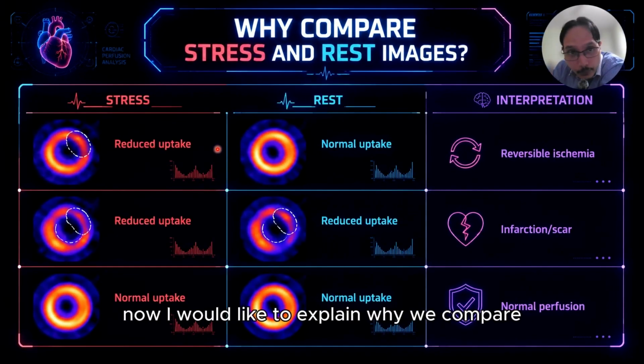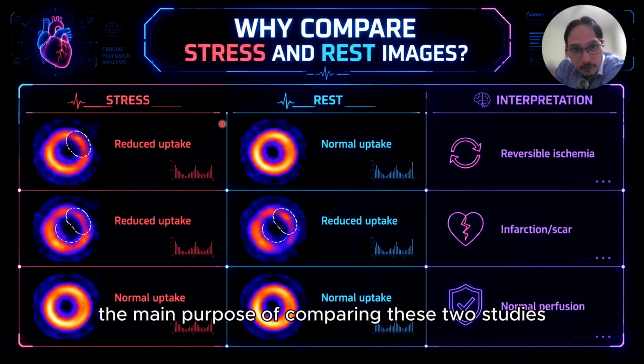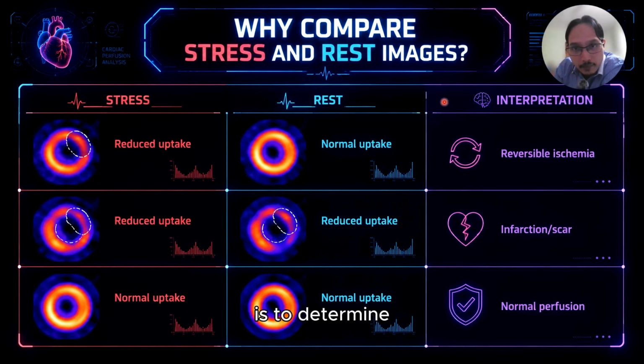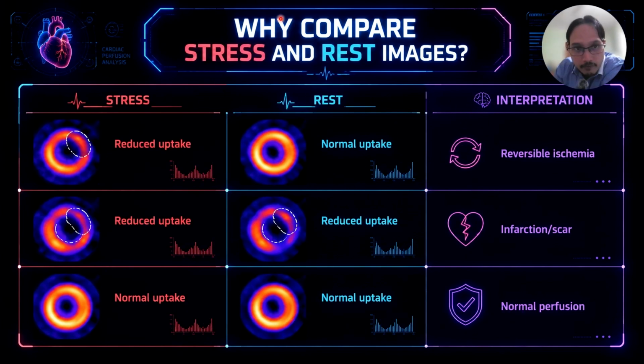Thank you. Now, I would like to explain why we compare stress and rest images in myocardial perfusion imaging. The main purpose of comparing these two studies is to determine whether a perfusion defect is reversible or fixed. First, let's look at the top row.